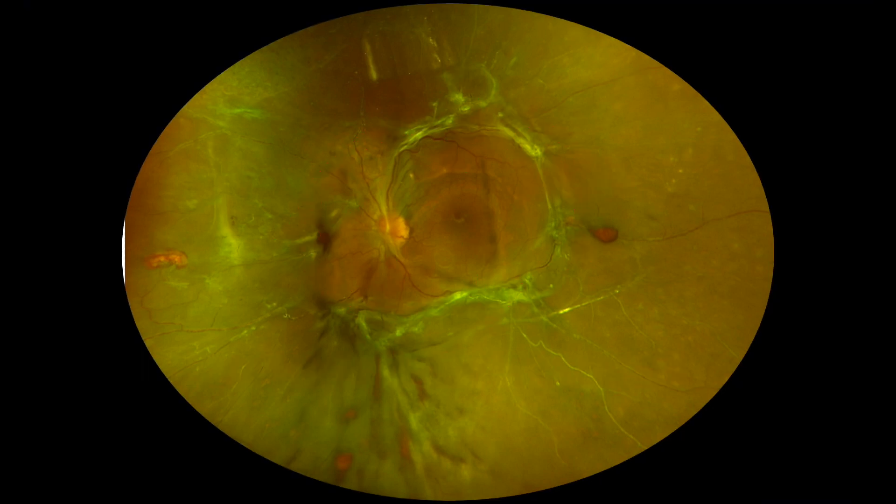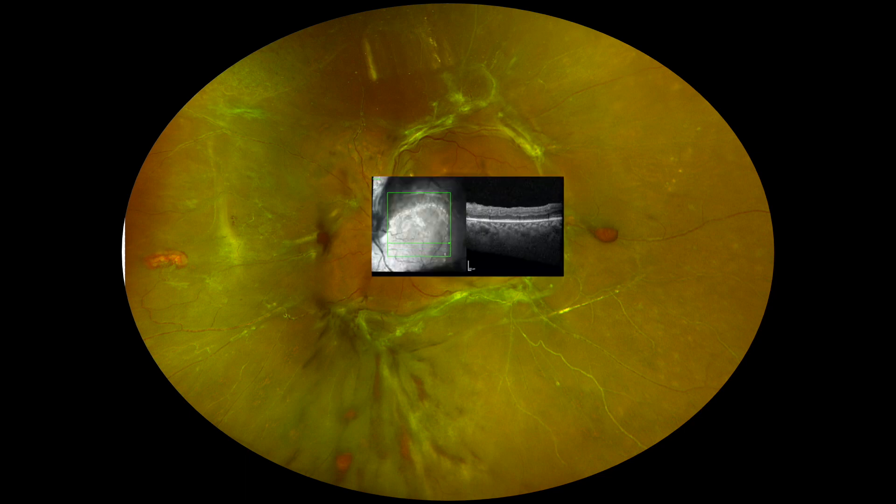This is a patient with a diabetic tractional retinal detachment. The patient has central vision, but it's very tubular and progressively getting worse with four quadrants tractional retinal detachment. That's the OCT of the patient. Here you can see the macula is even endangered.